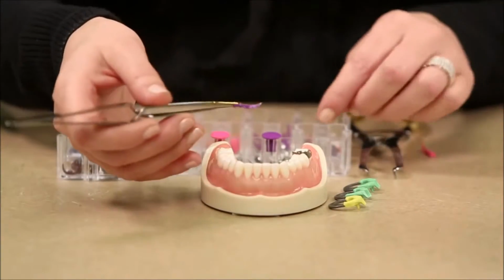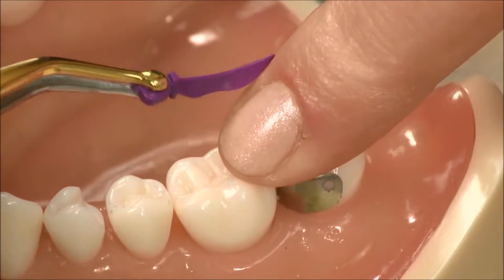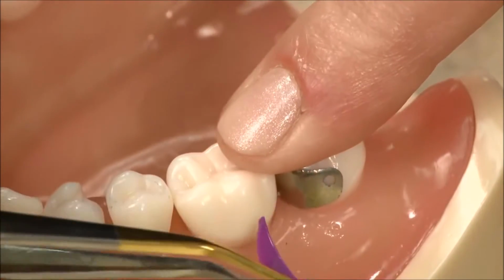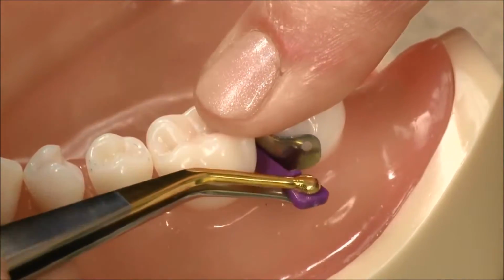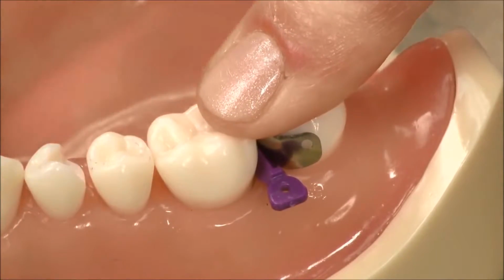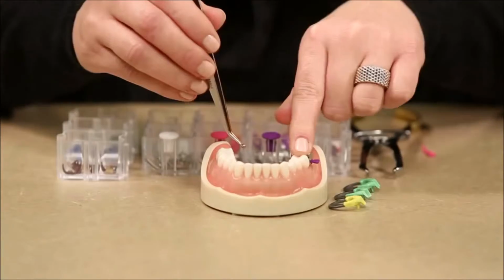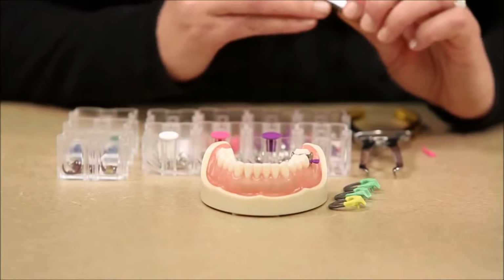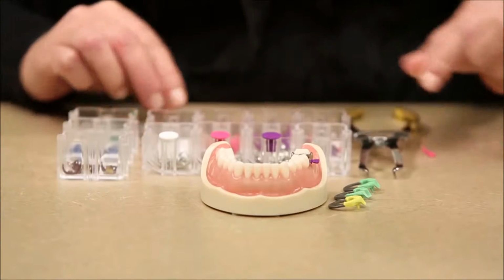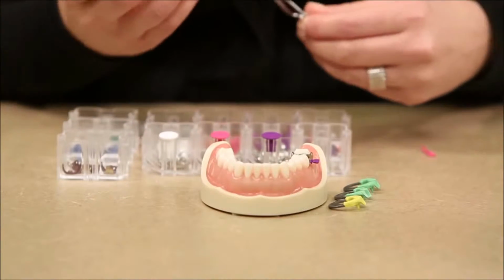So when I place the wedge, I'm going to put a finger on that tab because that's my little handle. I'm going to rotate this wedge on the back of my hand and then just go ahead and place your wedge just until you feel that resistance. You don't want to push that in all the way nice and hard like a wooden wedge. You're just going to place it until you feel resistance, and that's going to further contour that band. So with the wedge you have minimal separation, but you have really great sealing contour against the band.